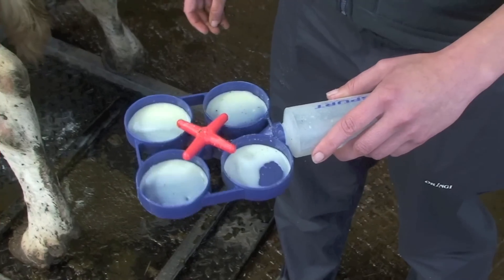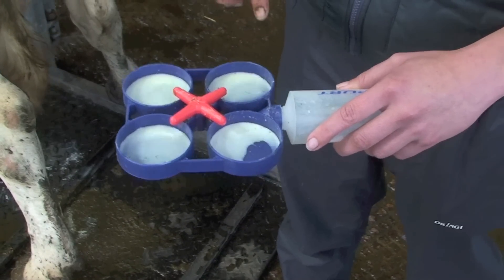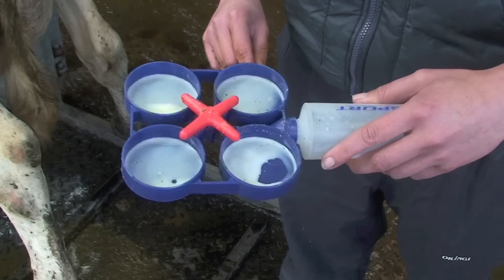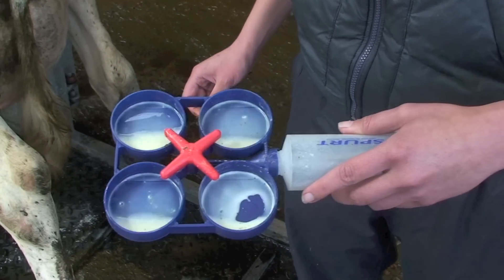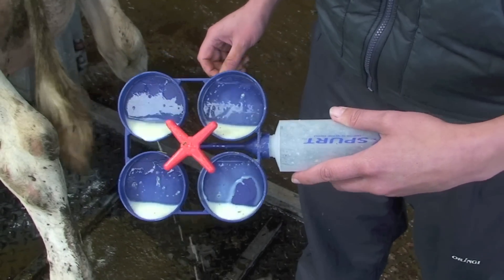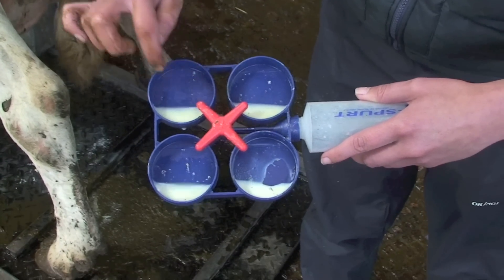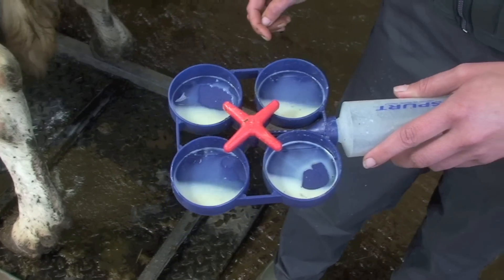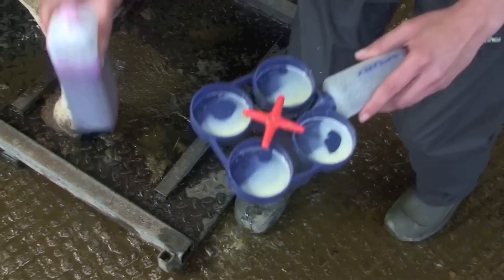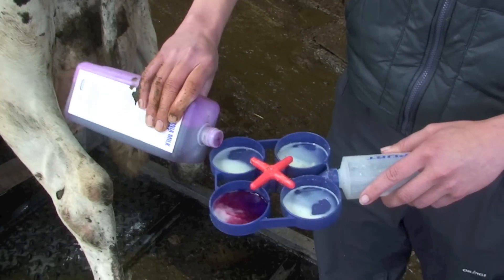We have the milk from each quarter of the cow. We know which sample corresponds to which quarter because we watched carefully as we collected it. We then tilt the paddle so that we've got three mils left in each well, shown by the graduation lines on both sides, so we have an even amount. Then we add the same equal volume of reagent as milk.